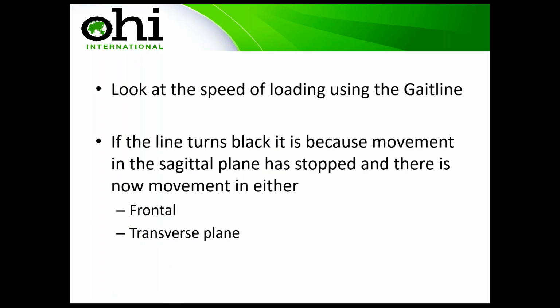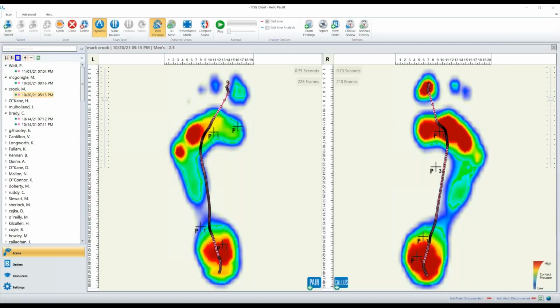So what I want to do is go back to the scans and just show you. So here's the difference between a scan, all forefoot, all the compensation that's happening at the forefoot here. There's a flag because, again, when you roll off the first MTP joint and you roll laterally, you're going to have issues with 2, 3, 4, and 5.